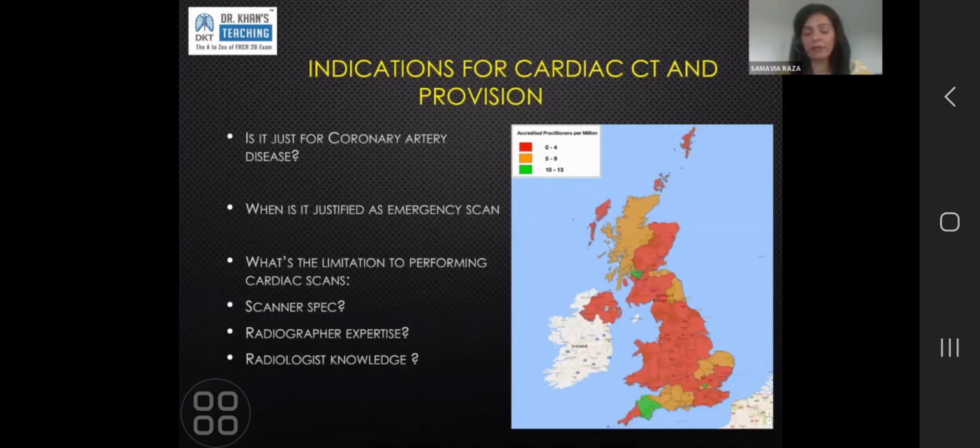The other very common scenario now is patients presenting with acute heart failure that have aortic disease. So there is a drive to doing urgent TAVI procedures, urgent aortic valve interventions. Those patients need a pre-procedure CT. That is technically a cardiac CT because it is done as a cardiac CT, and the reporters are the same, the radiographers are the same. So that's also an emergency justification.